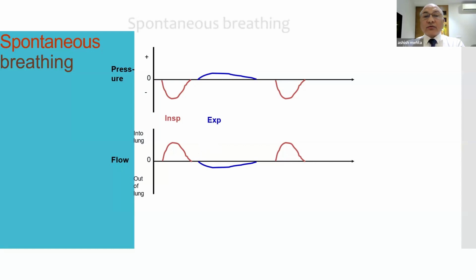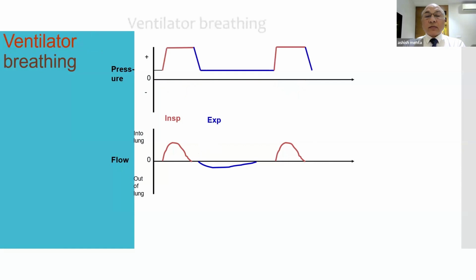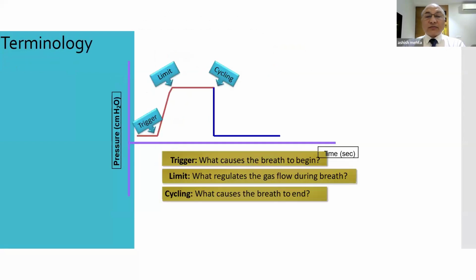When it comes to delivering a positive pressure breath, you can see here that both flow and pressure become positive. And that is why a mechanical breath is also known as a positive pressure breath.